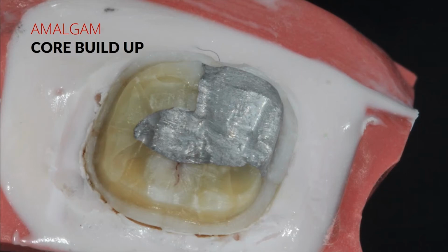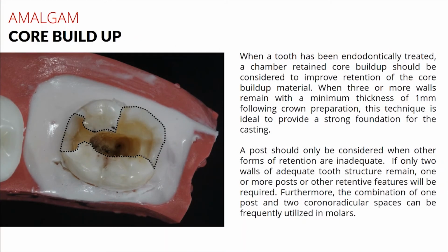So in this lecture, we're going to spend a short amount of time talking about core buildups. In a situation in which you have an endodontically treated tooth, a lot of times the tooth is going to come down pretty broken down already. So you're going to have some missing tooth structure and possibly even some walls or cusps that are missing. If you think about it, what we're trying to accomplish is we want to eventually get a crown here to cover the cusps here for cuspal support.